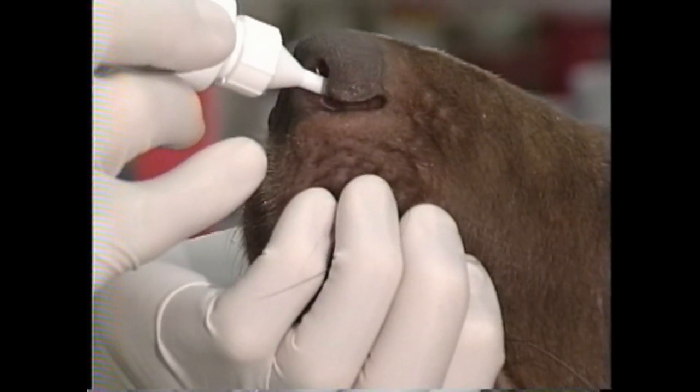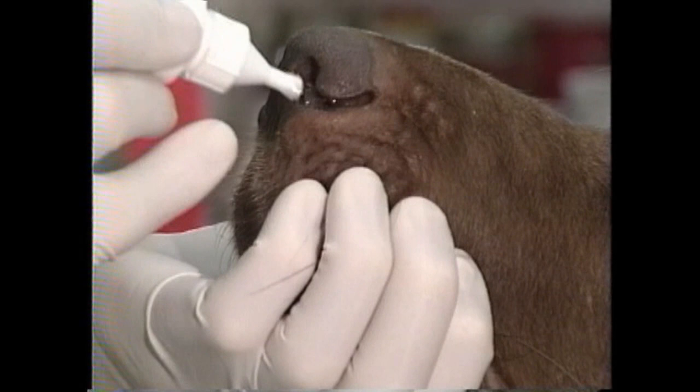Next I'll pack in a little bit of 2% lidocaine lubricant. This will help further numb the orifice of the nostril, and this viscous solution will gradually melt back into the nasal cavity providing lubrication and extra lidocaine for topical anesthesia.